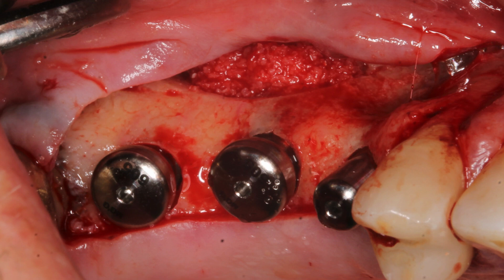Of course, at this point, the implants are fully seated, and we did achieve very good stability, so we felt comfortable placing the healing abutments. And just very quickly, the selection of the healing abutment. There are two things to consider, mainly the height and the circumference, or the diameter.